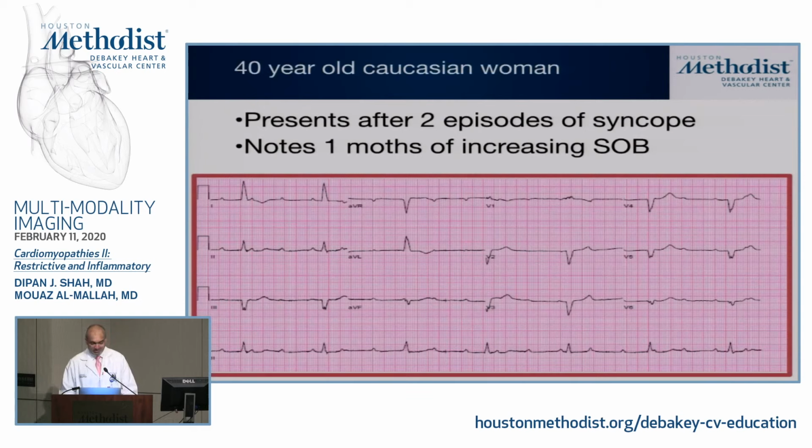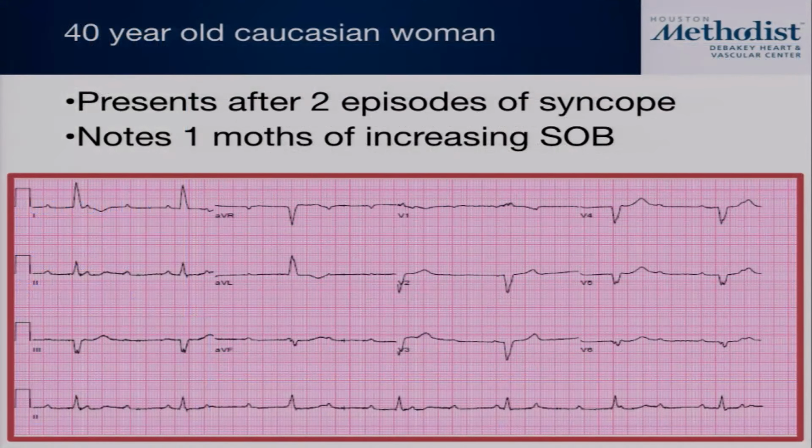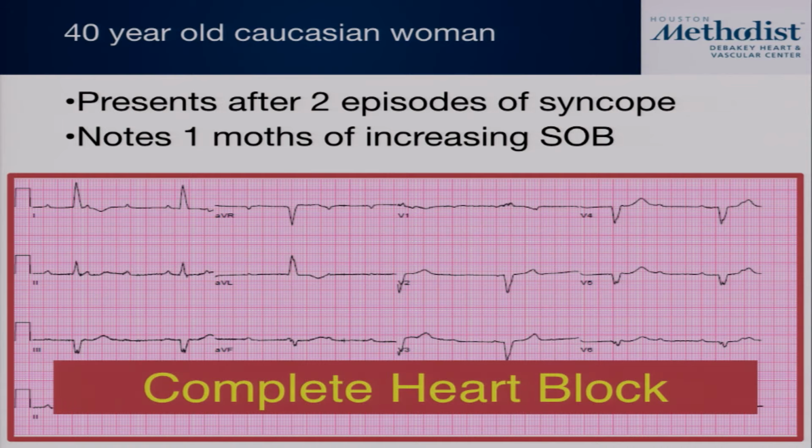Here's her 12-lead electrocardiogram. Anyone want to tell me what they see here? One of the first-year fellows. Are there any first-year fellows here? Yes, Tanushree. Very good. So this person's got complete heart block.